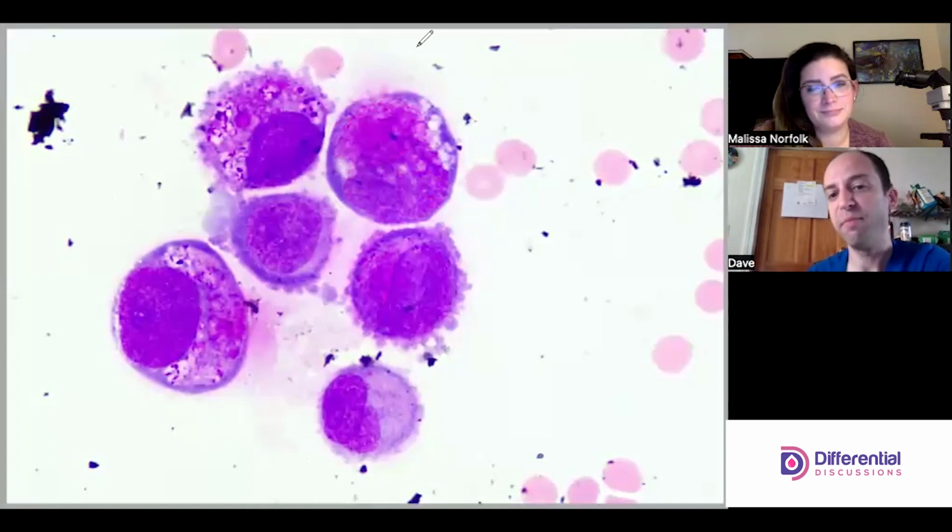Okay. I'm looking at this slide. These red cells look perfect. The staining on those red cells is bang on, right? I don't quite know what this is, right? But generally speaking, the staining characteristics of it are totally normal. So I can say with very high confidence, just from looking at this field, that my stain is behaving appropriately.